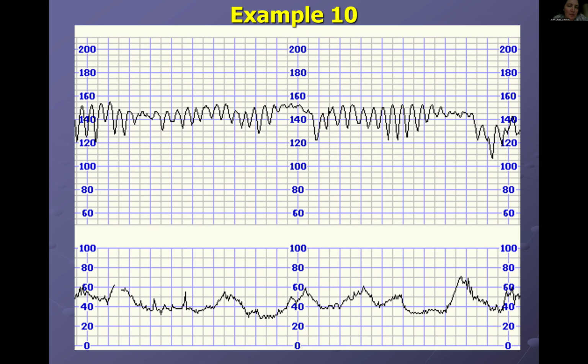So, delivered ASAP means by caesarean section, basically, if you want to save that baby. And even if you save that baby, it is very likely that the baby will be born with a low Apgar score.